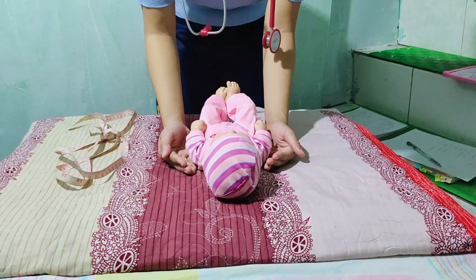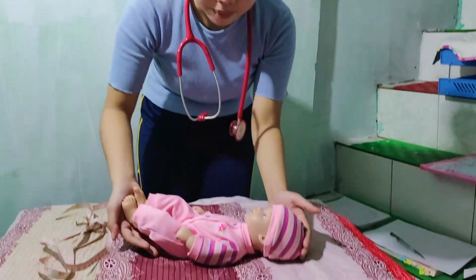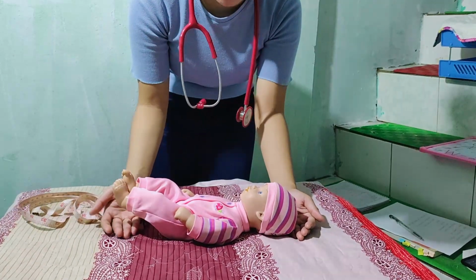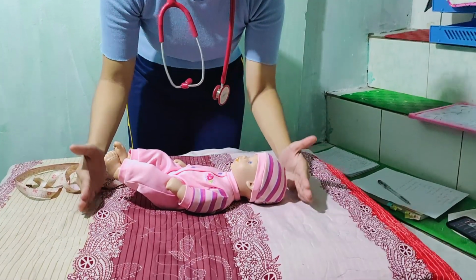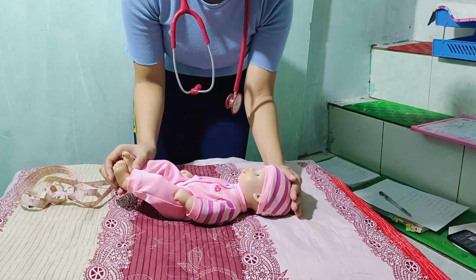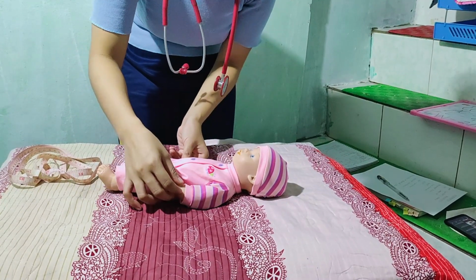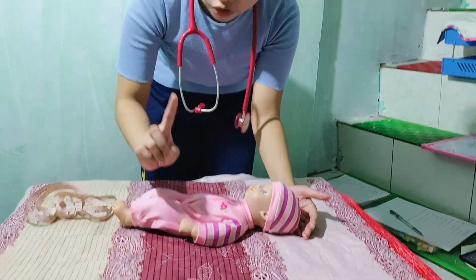Now, we will measure the height or length of the baby. First, we will position the baby. We will use a tape measure, but in some hospitals, they use the infantometer. It is designed for infants. It has a base here and another base here, so the baby will be fixed on the measurements. But this time, we will just use a tape measure. Make sure the baby is straight, and also her hands. The baby must be stable and calm and not crying.